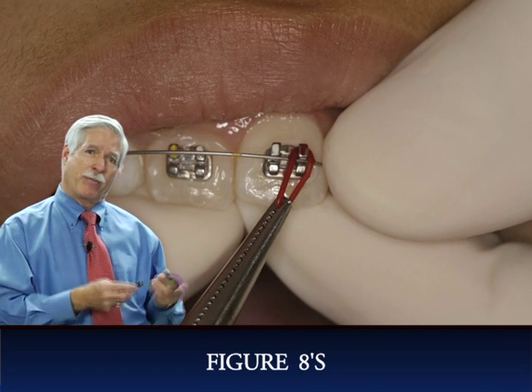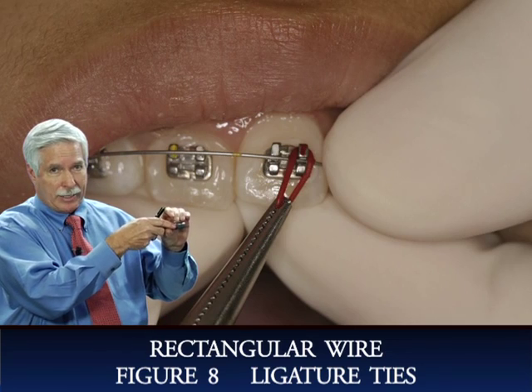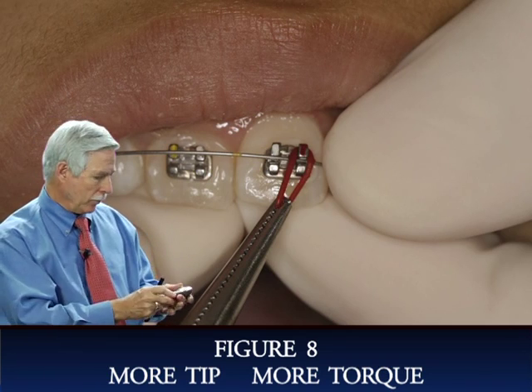Now, at the end of treatment, when the teeth are moved in the proper position, and we really want to sock that wire into the base of the bracket slot, we will do this figure 8 because we get more torque and more tip expressed in the bracket when we do that.